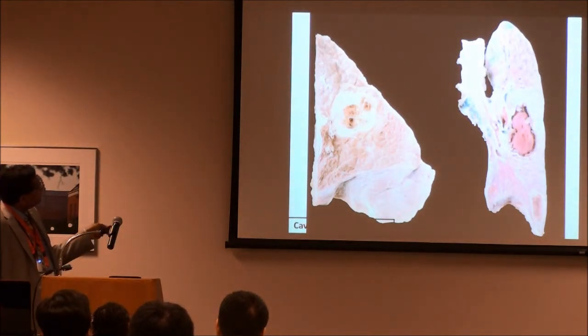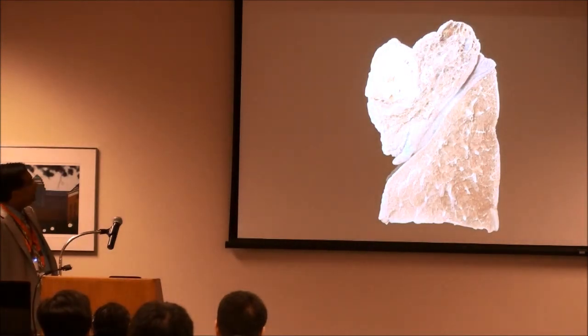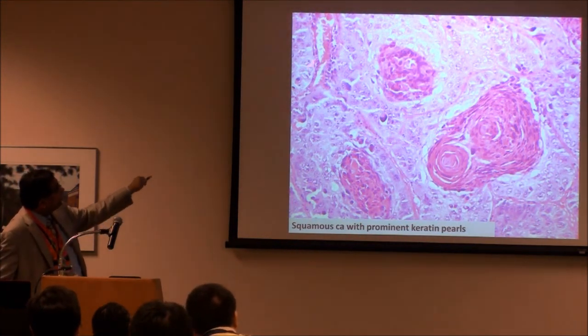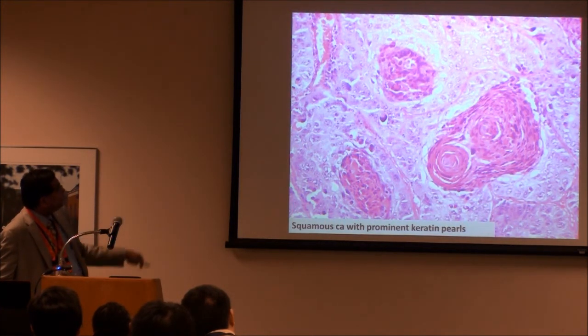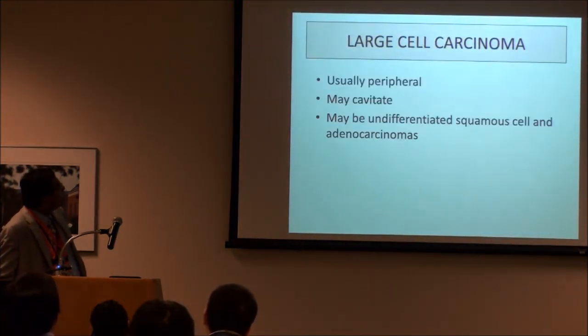Again, look at this big cancer here. It's all necrotic in the middle. The tissue is falling apart. That's a lung cancer. So this gives you a little visual picture of what lung cancers look like. Histologically, when I make sections, I can see all these bad-looking tumor cells and a lot of keratin. Keratin is what squamous epithelial cells make. So this is a squamous cell carcinoma.